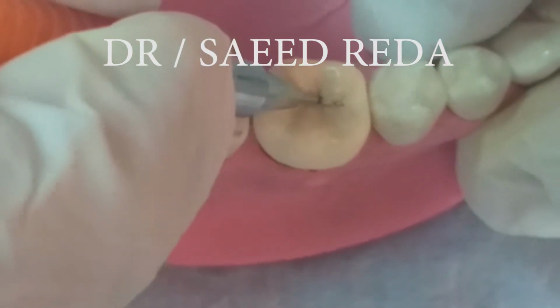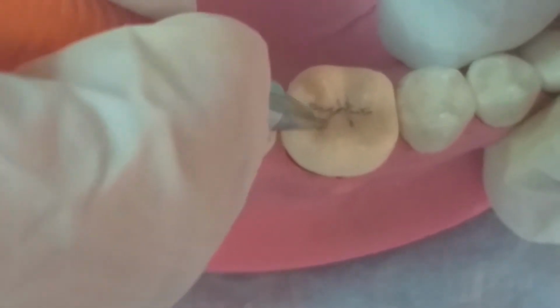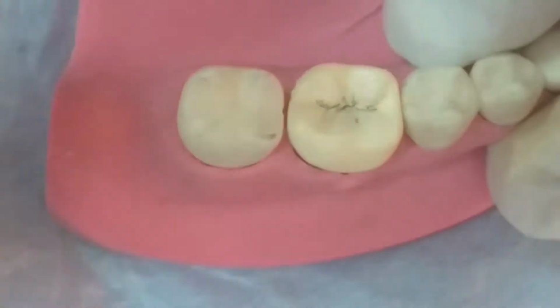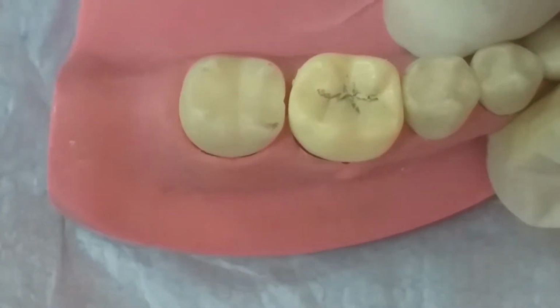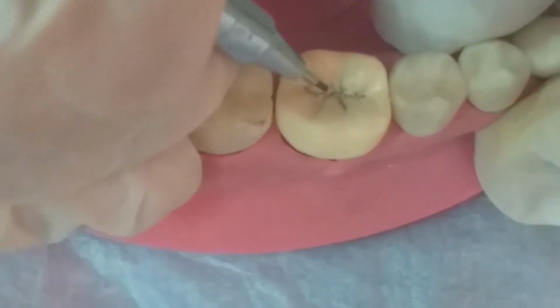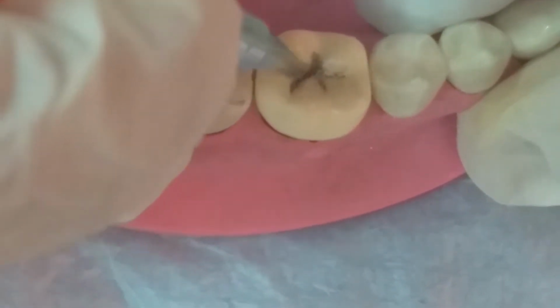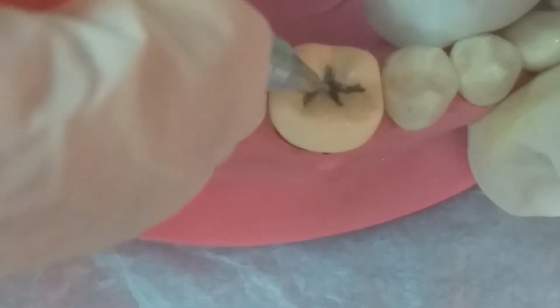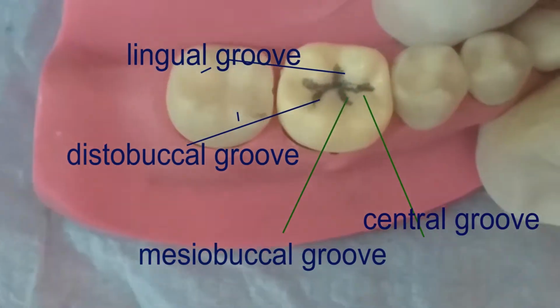In the beginning, we attempt to draw the outline form which resembles our preparation. We draw it for class 1 in the central grooves from the mesial fossa to distal fossa, and then we draw the other developmental grooves, mesiobuccal, distobuccal and lingual grooves, as we see in our preparation here.